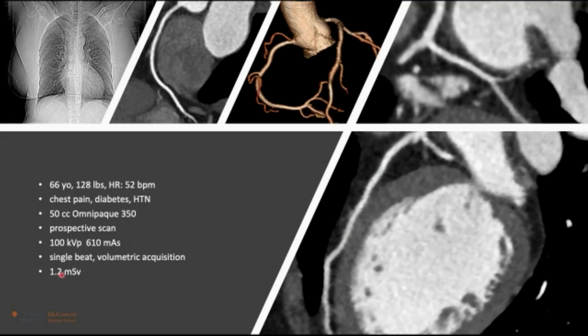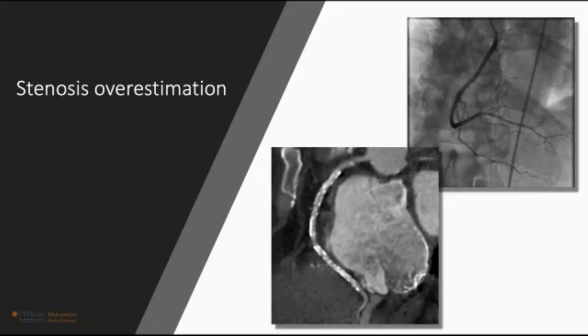1.2 millisieverts in an average sized person for a heart rate of 52 beats a minute, whole heart single beat volumetric acquisition. I would say it came out beautifully.